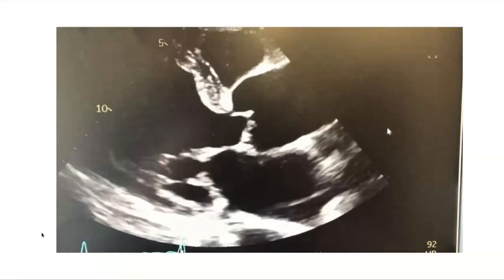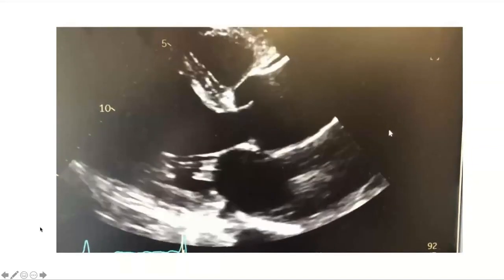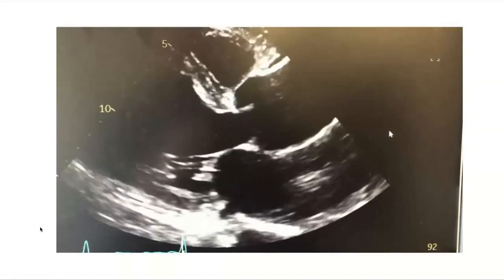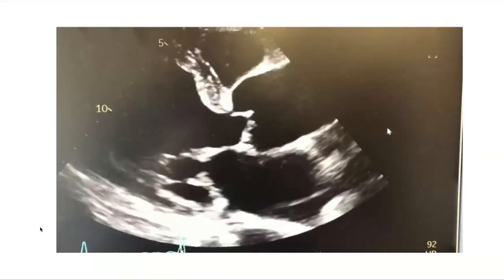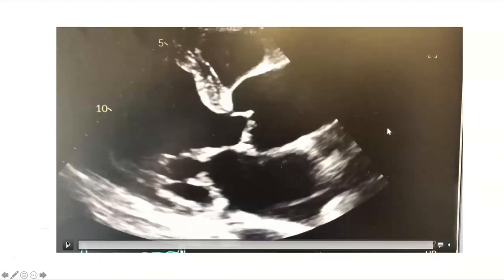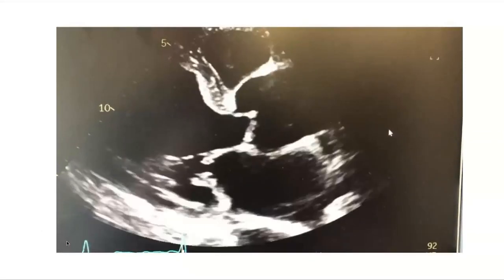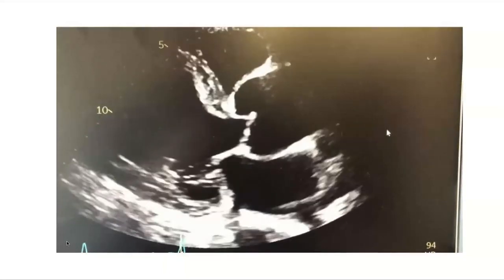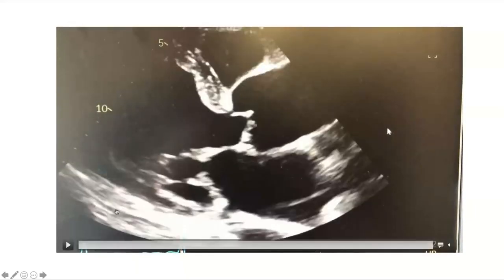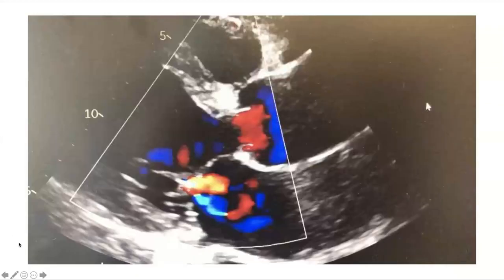So we'll measure and see if this is aneurysmal or if there's some other abnormality associated with that. Obviously, you're going to show us additional images. We'll put color on. We'll see if there's any valvular pathology in terms of a regurgitant jet or anything like that that might be associated with this. Absolutely. Just because you asked, we'll go to some color.